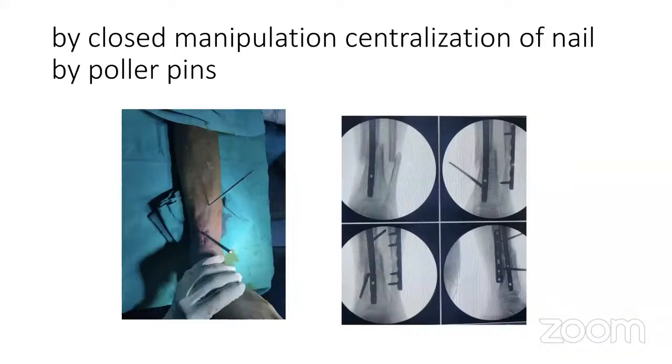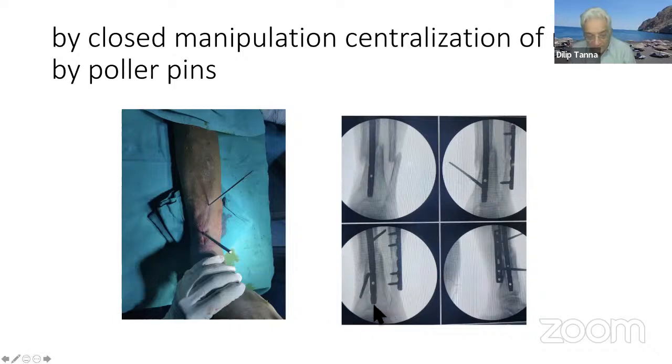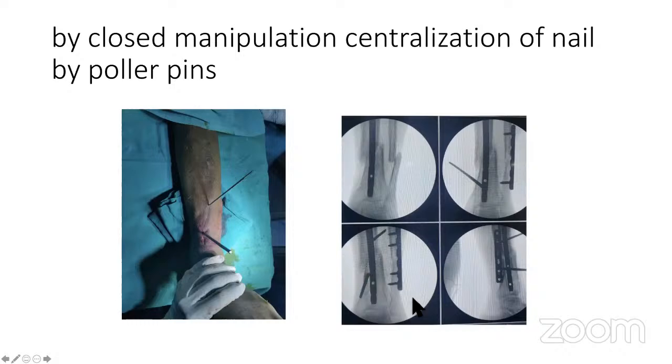Next. You can see here how I regained the length of the fibula. And then I tried to centralize the nail by putting two Poller pins, in the distal fragment as well as the proximal fragment. Sorry, Gary. Yes, sir. The nail is in the center. You tried to correct this deformity? Yes, sir, I tried to correct the deformity by closed method.